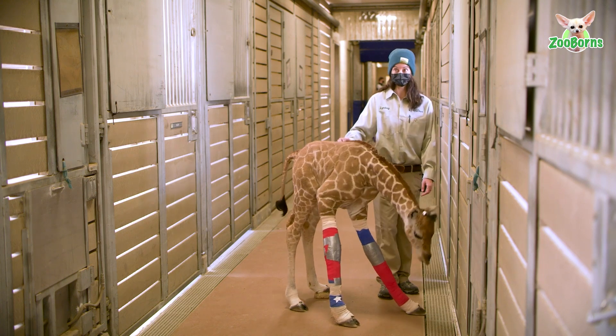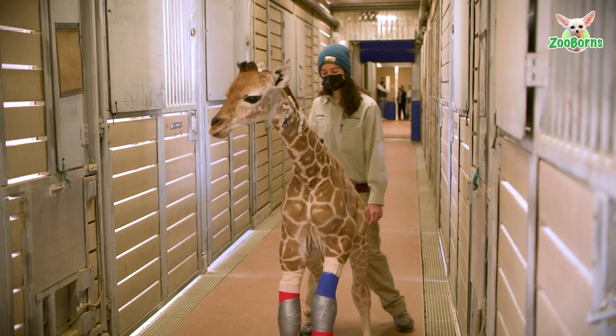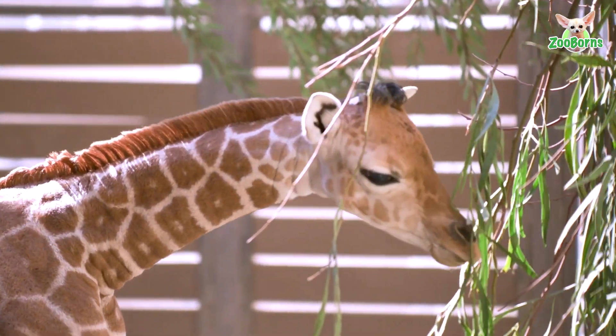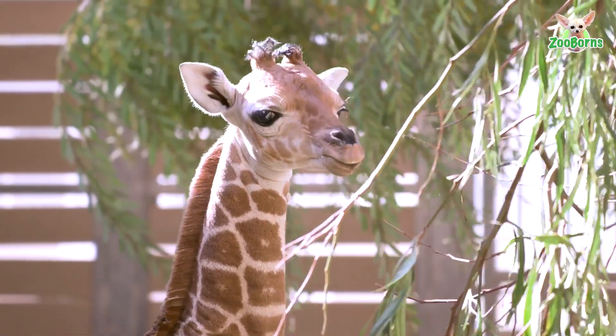This giraffe has been braced for about 10 days now. The brace we put on her today is hopefully going to push her through at least another couple of weeks to make sure she's not going to hyperextend on that left forelimb. Our hope is that in about 7 to 10 days we can take the brace off and determine if her ligaments and tendons have strengthened enough where she no longer needs it.